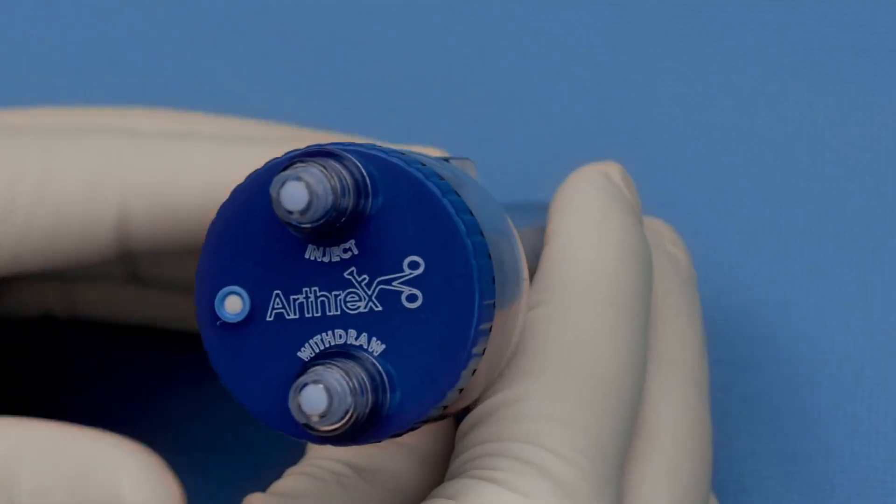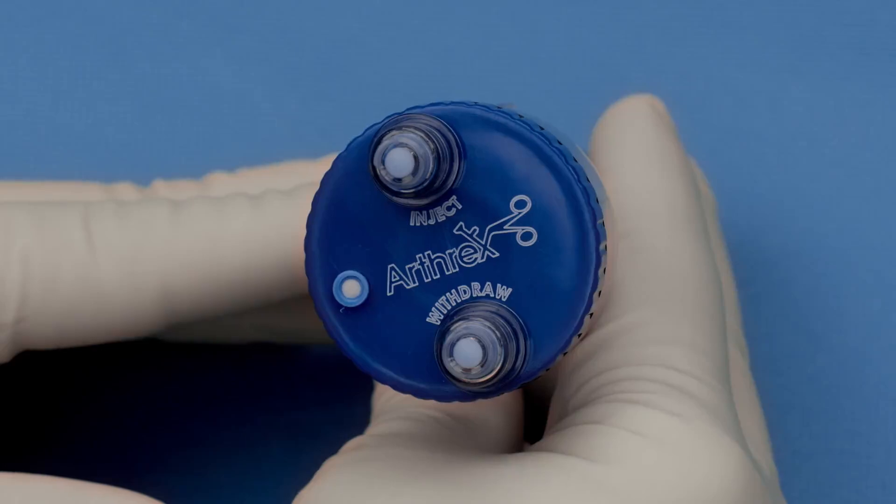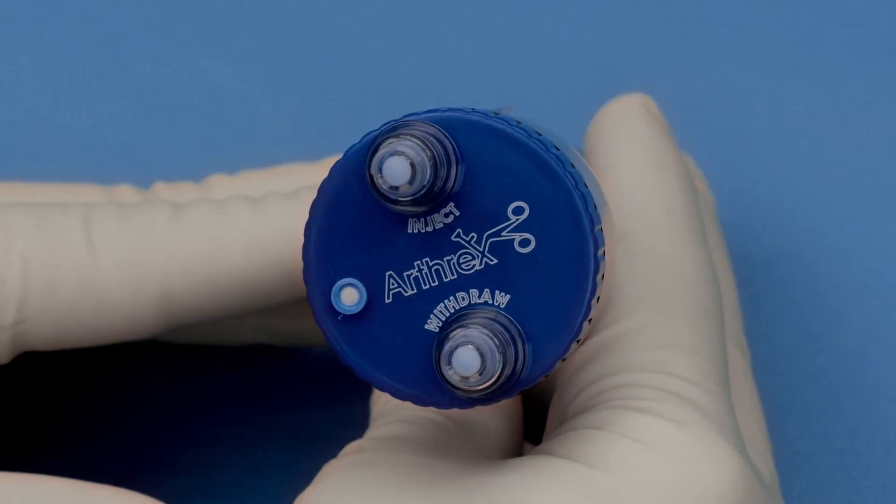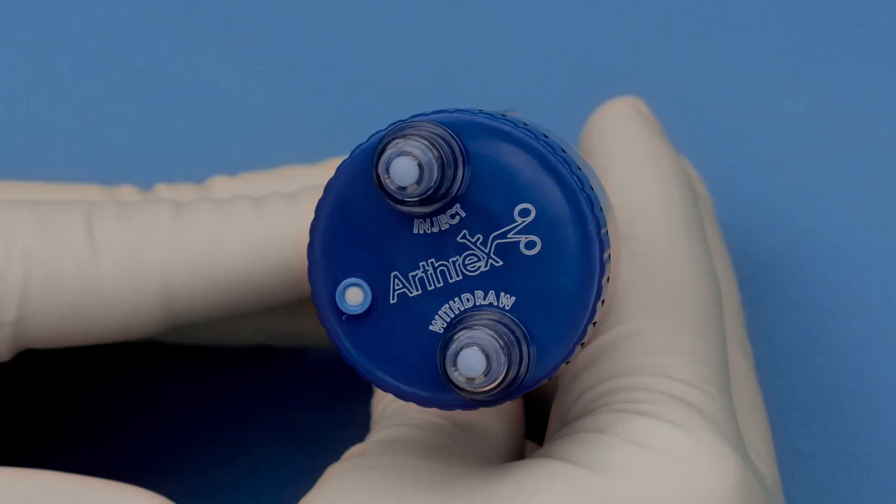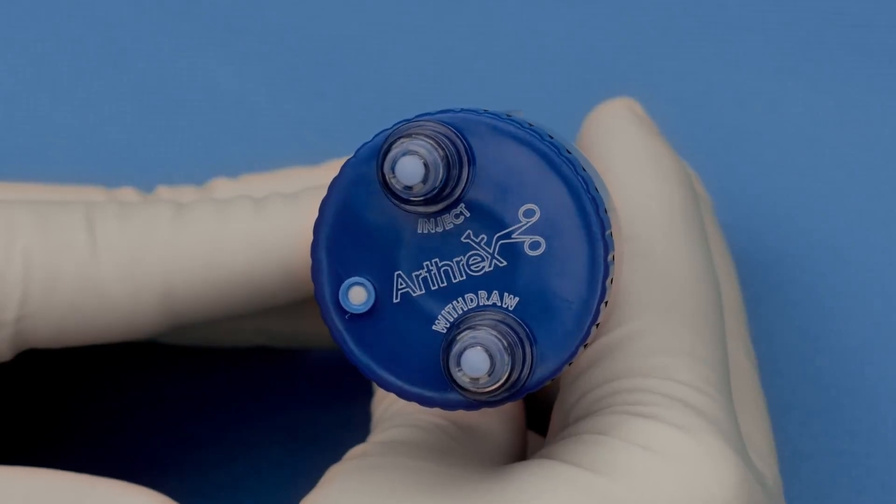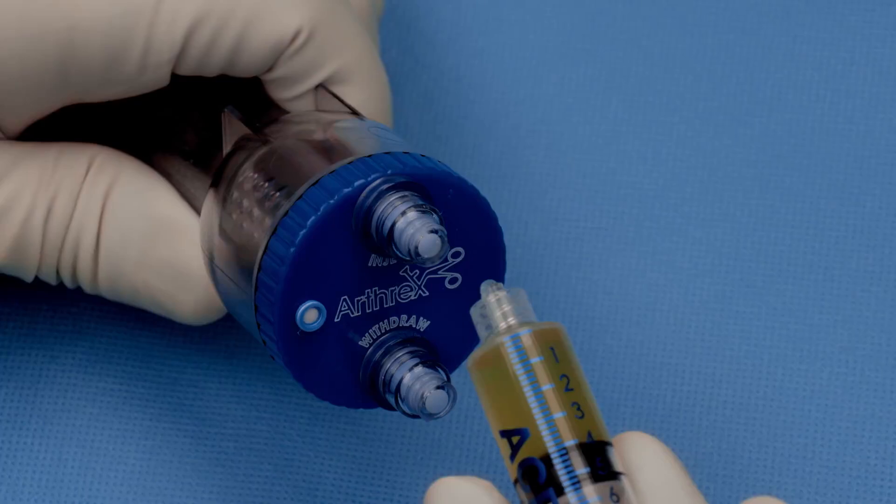On top, the thrombinator has 2 insertion points, one for injection of the ACP and the other one for withdrawal of the autologous thrombin.